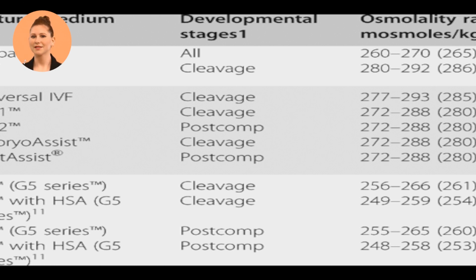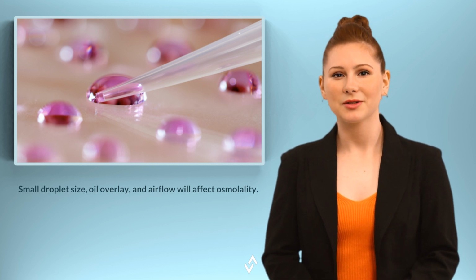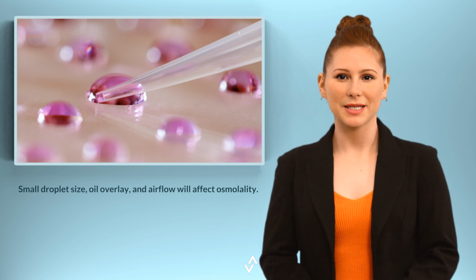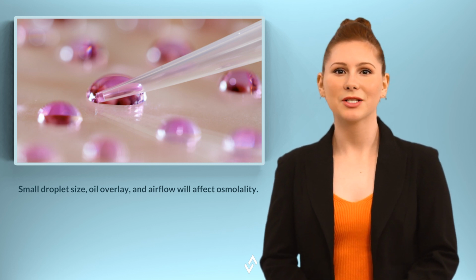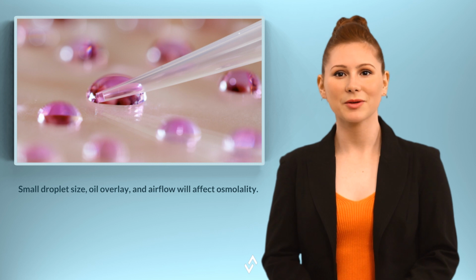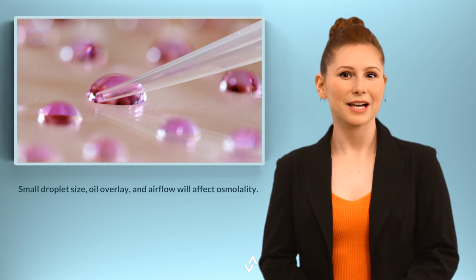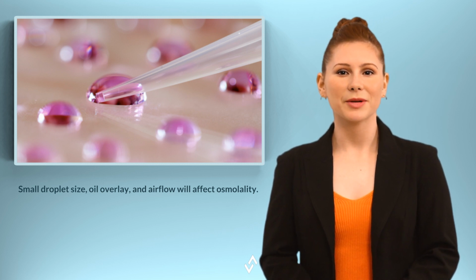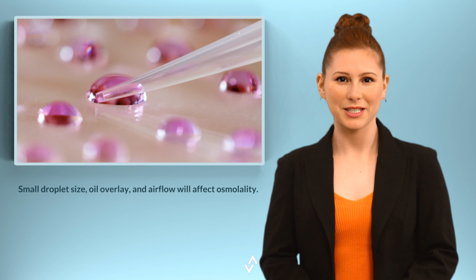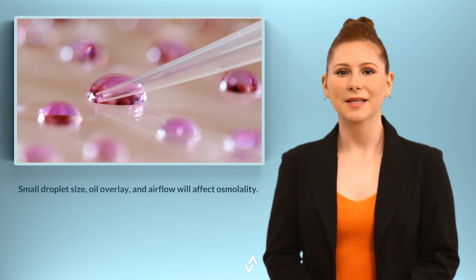embryo development. If evaporation is occurring under the culture conditions that are used, then osmolality will increase each day over time. The specifics of the culture system, such as humidity, oil density, affect evaporation. Most IVF labs still change media on day 3 to avoid excessive evaporation, because the media will experience only 3 days of evaporation instead of 5 or 6 days.